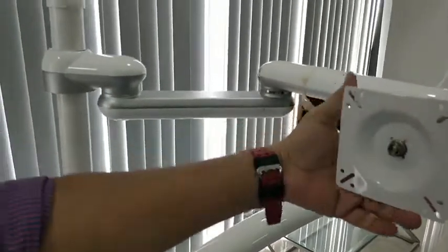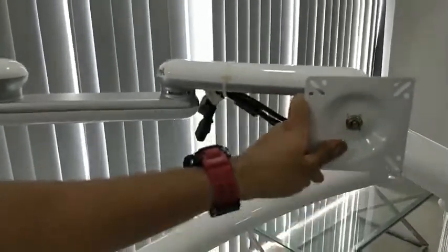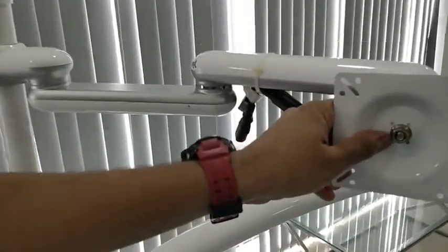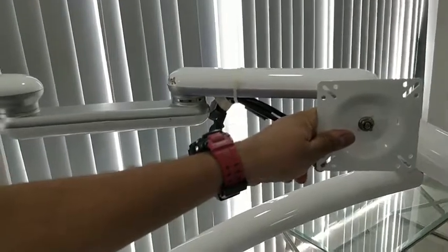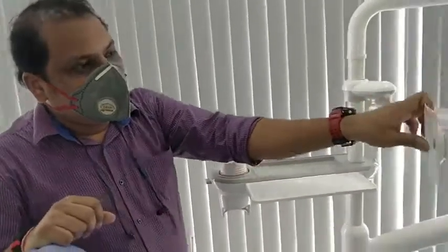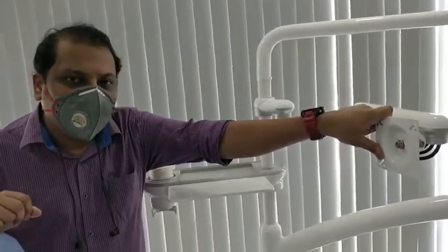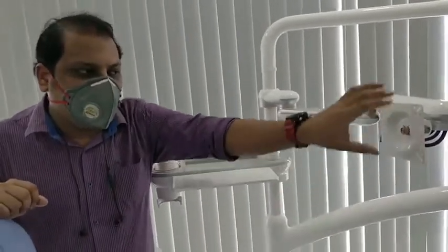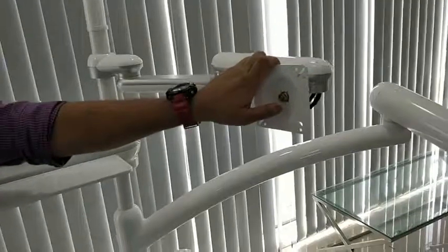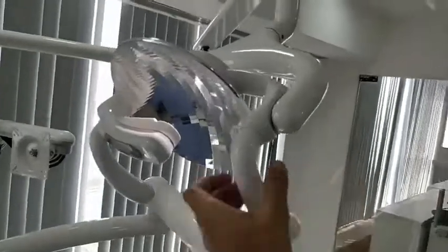The monitor arm allows the monitor position to be changed to show content to the patient, patient's relatives, or assistant doctors. Additionally, when Austin releases its own intraoral camera snap, you can connect it to the panel and display the intraoral camera feed on this monitor.